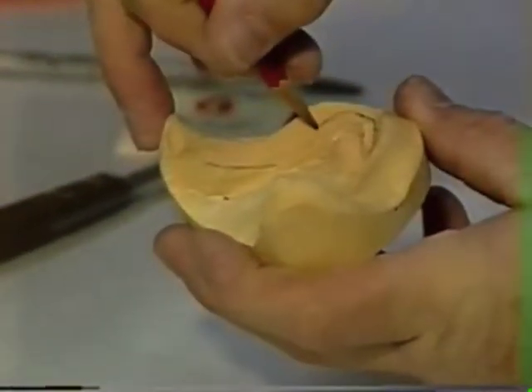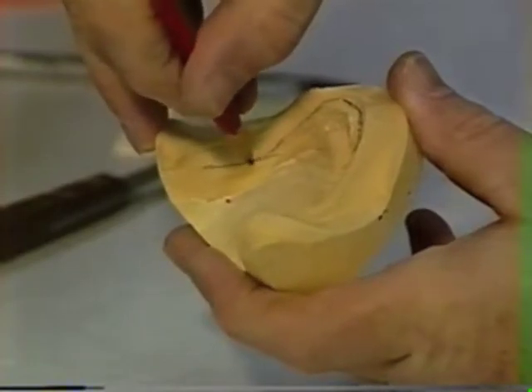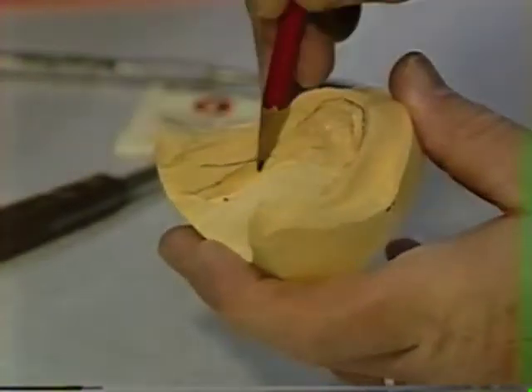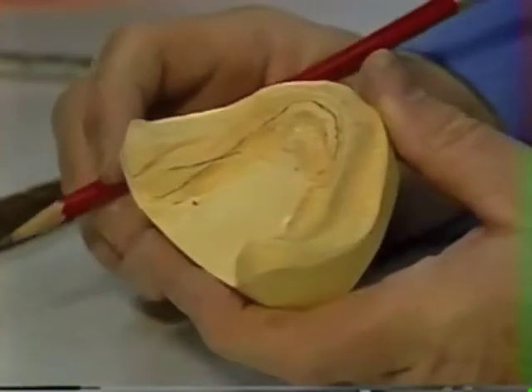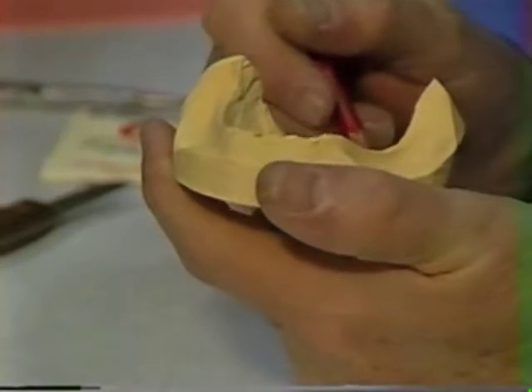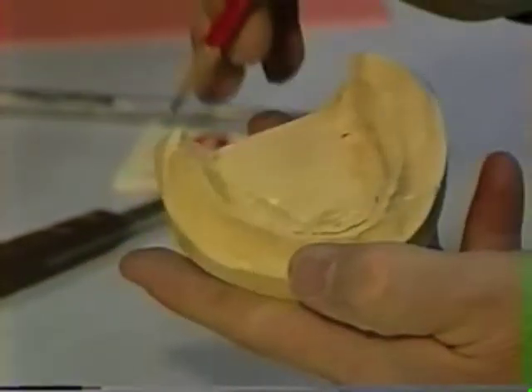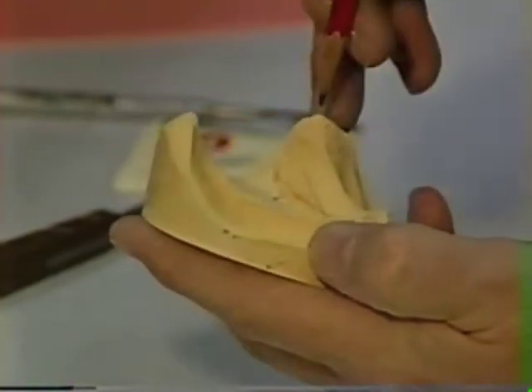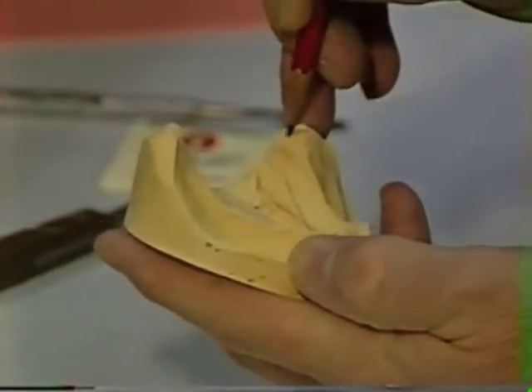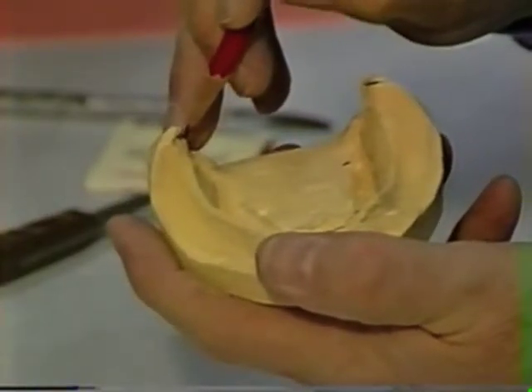It's going to follow the crest of the ridge in one plane, cross the mylohyoid ridge in the area of the first molar and continue into infinity. Next thing that you want to realize is the retromolar pad. We're going to start the design of the distal end of the tray, distal lingual of it, by first identifying the retromolar pad, which would be here. And the same on the other side, the retromolar pad here.